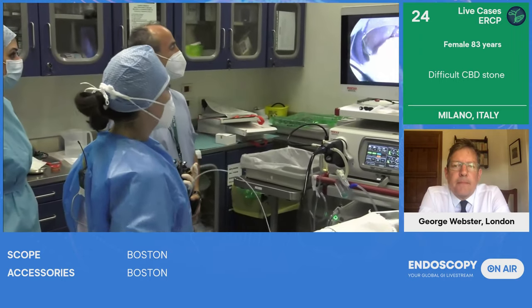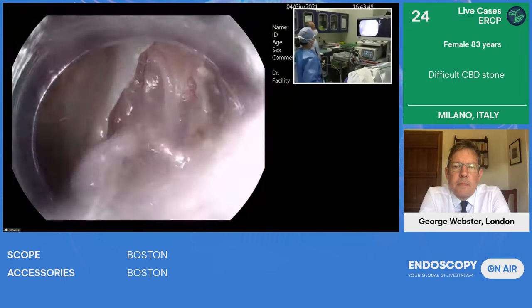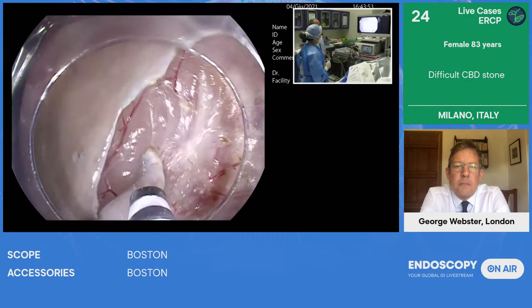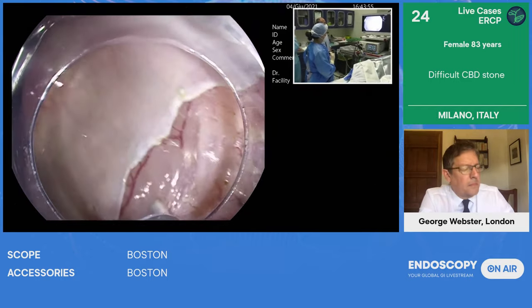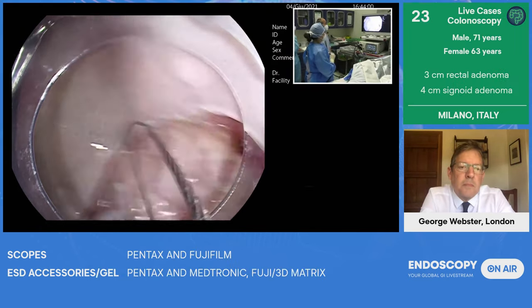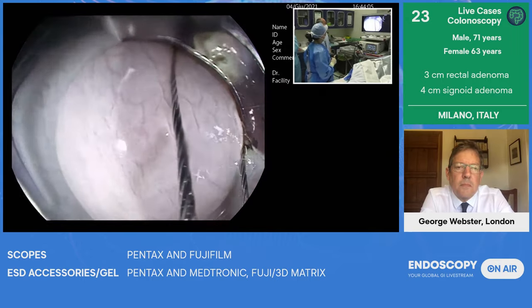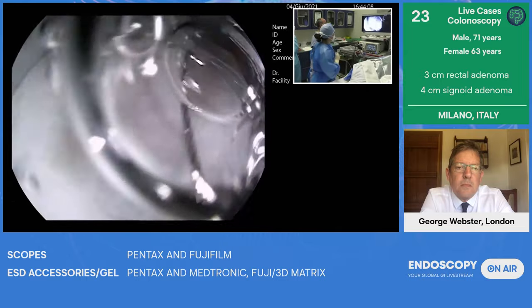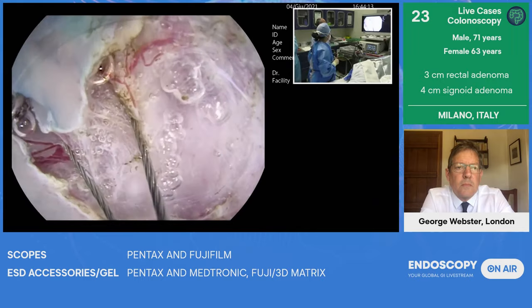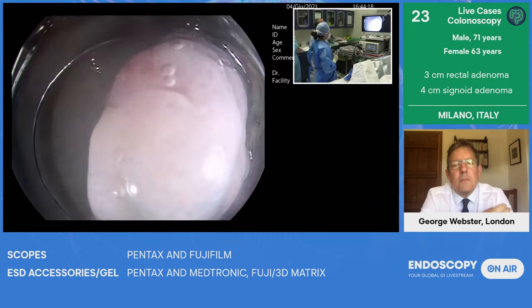Okay, good, good. So particularly proud of what Roberta is achieving. It's about 15 minutes. You got the lesion. So can you show now the last part? Yeah, I will open fully the device and you will see that it's a snare. It's a 22 millimeter snare. So I will catch the lesion that I completely and almost removed by standard ESD with the same device. You can start closing, close, close, close, stop. And then just apply the current.